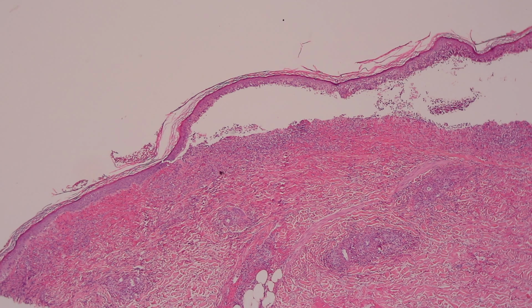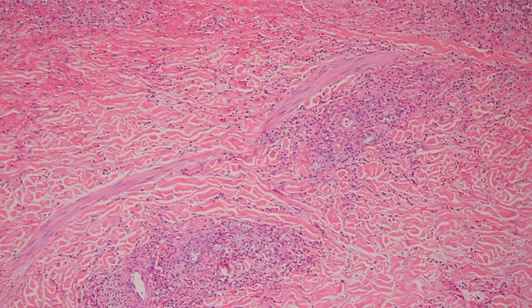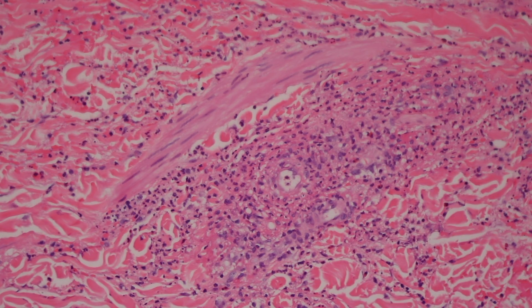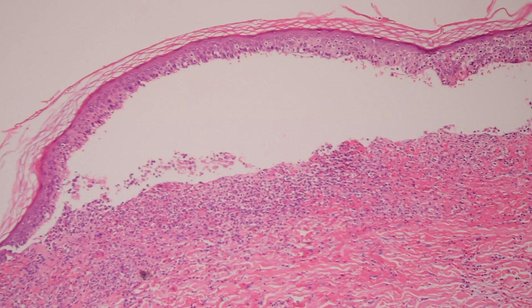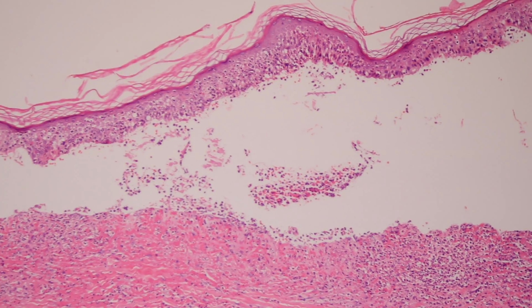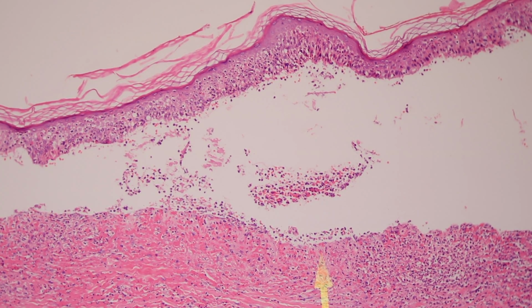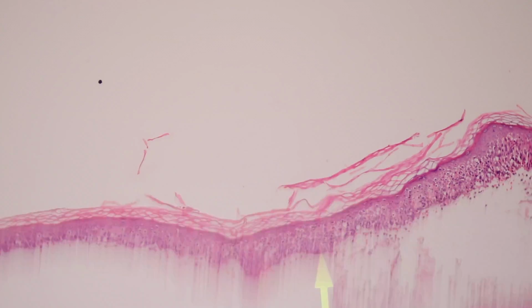So we use terms like bullous leukocytoclastic vasculitis to describe this, when there's clinically blisters present, and this is what it looks like microscopically. Numerous vessels involved by vasculitis, usually deeper involvement in the deep dermis by vasculitis. Again, really nice example of a vessel with damage and fibrin and neutrophils and debris around it. And then up here you can see the epidermis is detached and there's numerous neutrophils both kind of infiltrating the detached epidermis and down underneath it here in the blister cavity and just below. So that's bullous LCV.